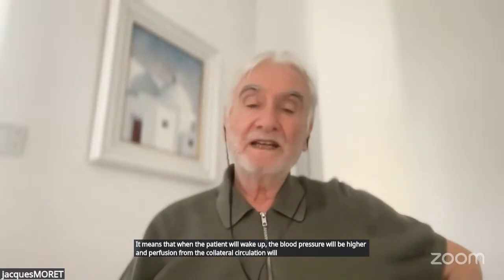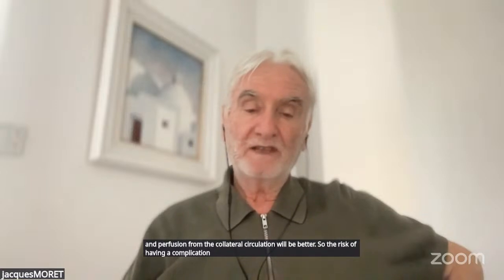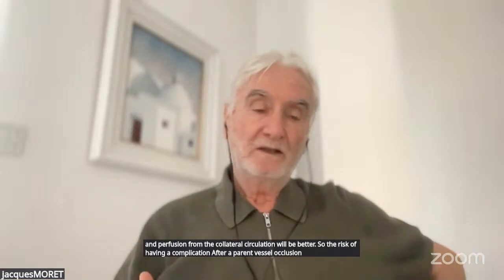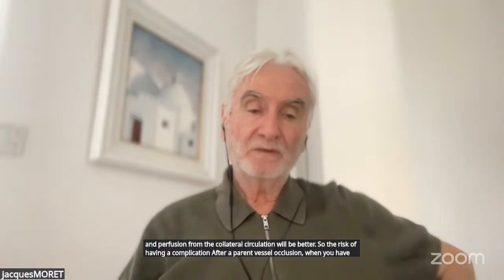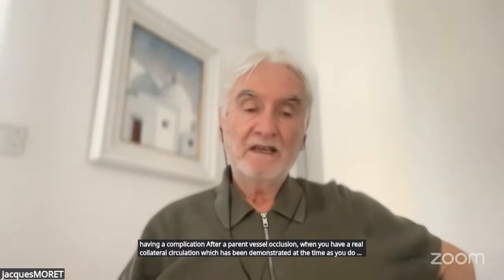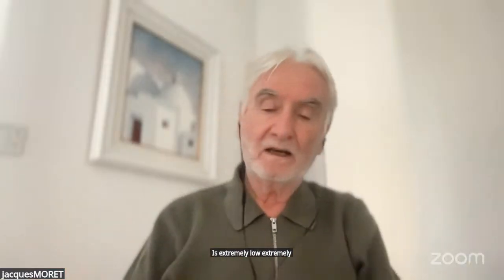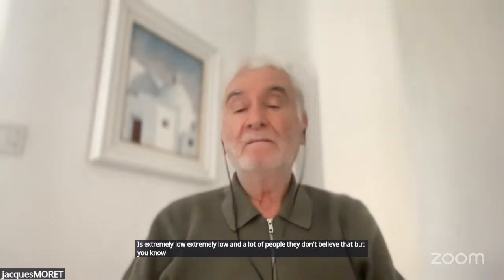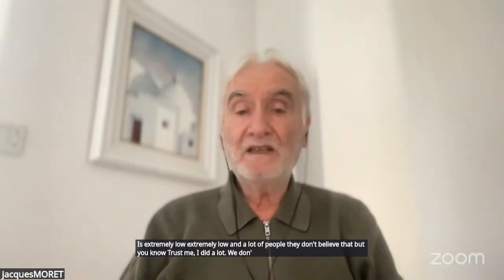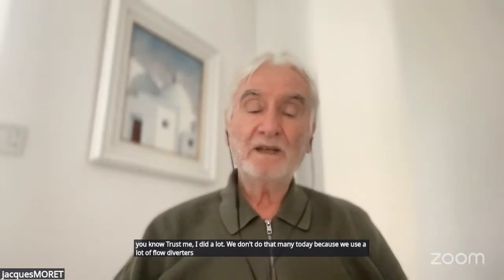So the risk of a complication after parent vessel occlusion, when you have a real collateral circulation demonstrated at the time of the test occlusion, is extremely low. A lot of people don't believe that, but trust me, I did a lot. We don't do that many today because we use a lot of flow diverters, but each time it's complicated.